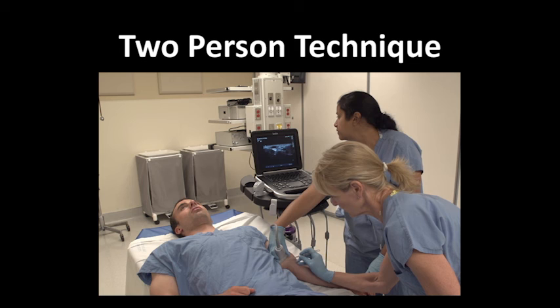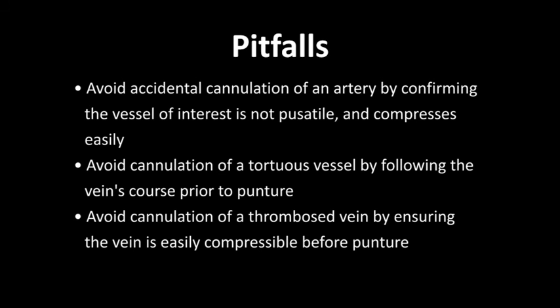Choose a comfortable position for the patient and the providers. Avoid accidental cannulation of an artery by confirming the vessel of interest is not pulsatile and compresses easily. Avoid cannulation of a tortuous vessel by following the vein's course prior to puncture. And avoid cannulation of a thrombosed vein by ensuring the vein is easily compressible before puncture.